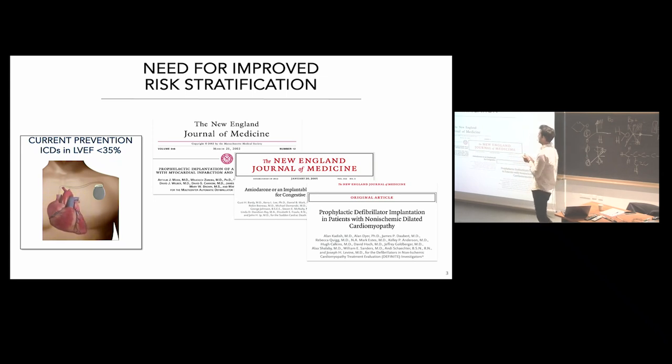And today, the cardiologist will base this decision on one parameter, which is called the left ventricular ejection fraction, EF. And we will get this parameter with MRI or with the Jean-Luc's ultrasound device. And if it's below 35%, the guidelines are saying we will implant the defibrillator in this patient. If it's above 35%, we don't really know. And it's likely that we won't implant this defibrillator.